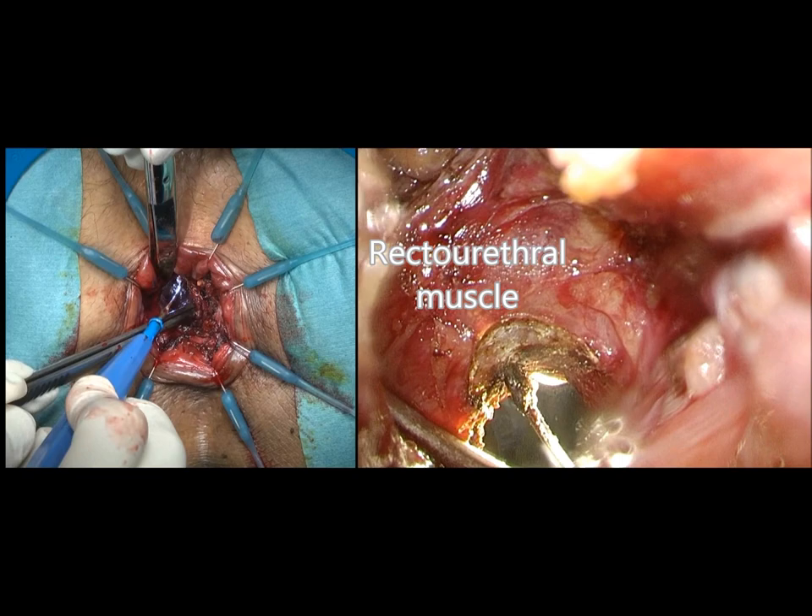On the anterior side, you see the pink recto urethral muscle and the whitish perineal body behind it.